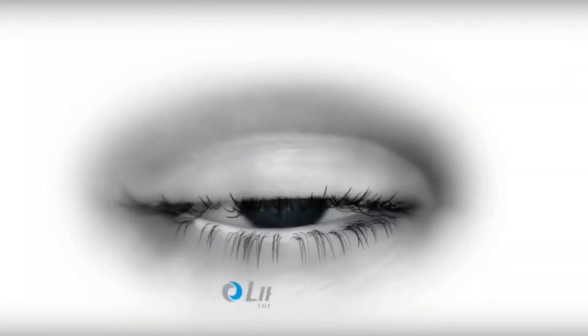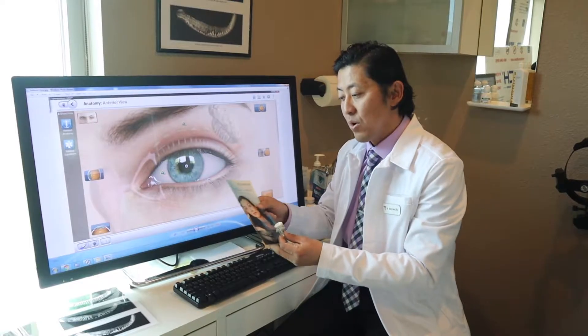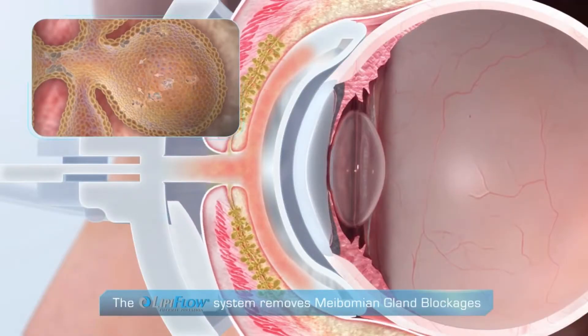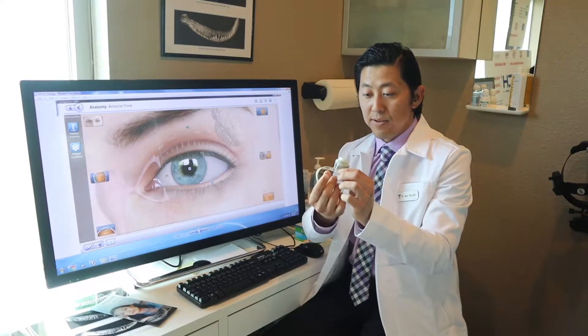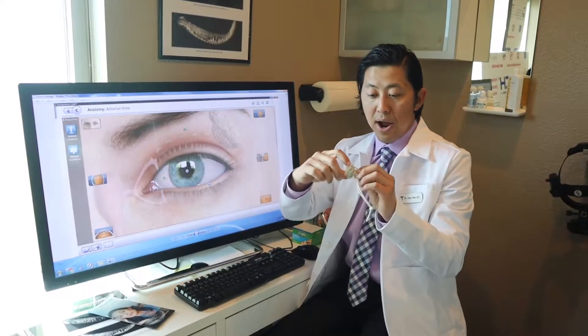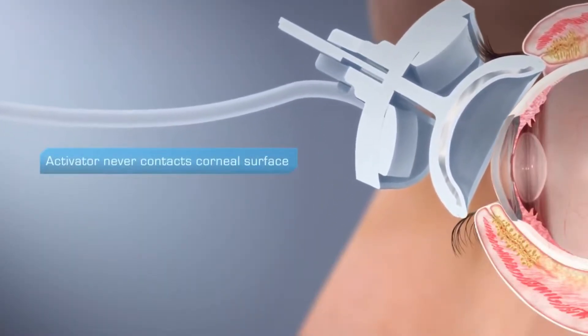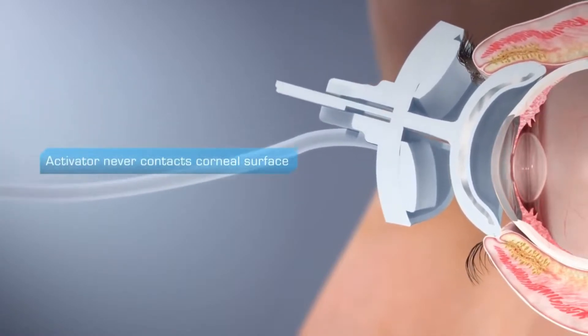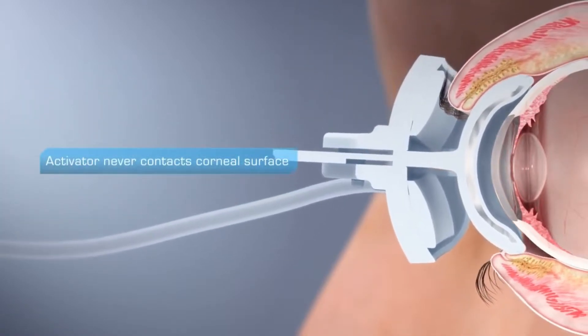This right here is called the LipiFlow. It's a dry eye thermal treatment of your eyelids to release the oil from your meibomian glands. It's a pretty crazy looking device, but it's essentially just like one big contact lens that goes on your eye like this, and your eyelids actually tuck in between the ceramic bowl and the phalange that holds your eyelid on the top and bottom.